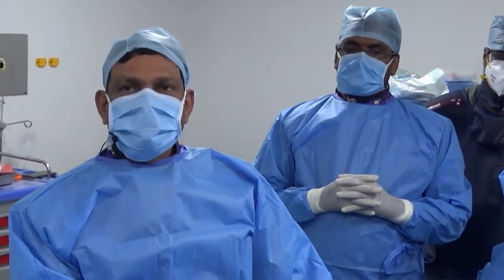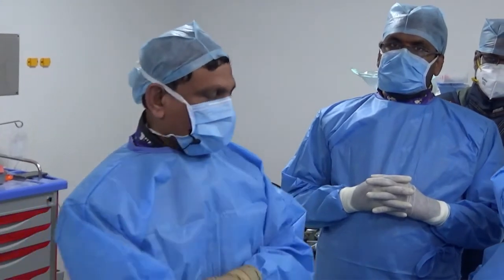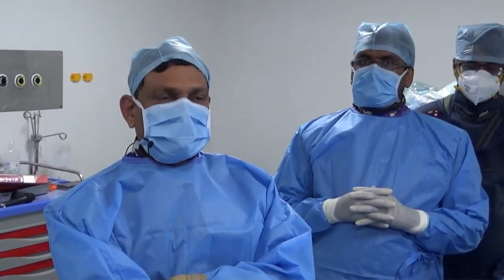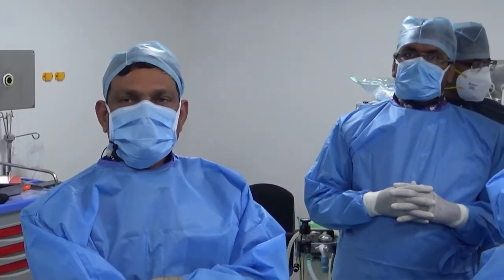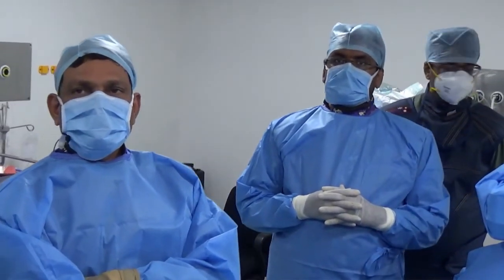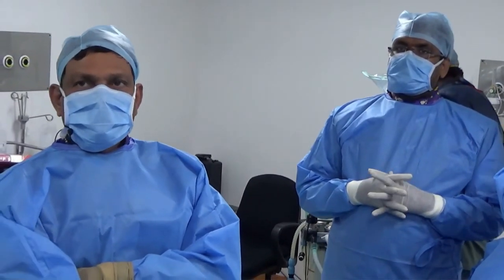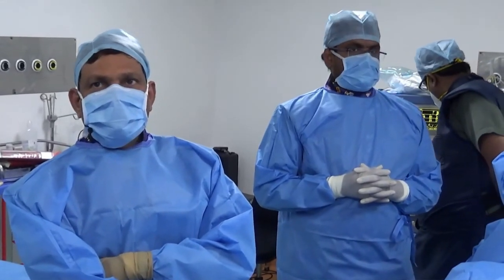See, actually, it's easy to decide when you have the data, 1.5:1. Often we don't have the data. You take the patient to the cath lab and then you don't want to catheterize again. So personally, I might have actually closed such a fistula. I'm not trying to say that I won't do such a fistula. It's totally borderline. But I think we all have to collectively acknowledge, for the sake of the audience, that this is a case where it's a bit tricky to take a decision, where we're balancing benefit versus harm. I think you can be damned either way. Yes, either way you can have a problem.